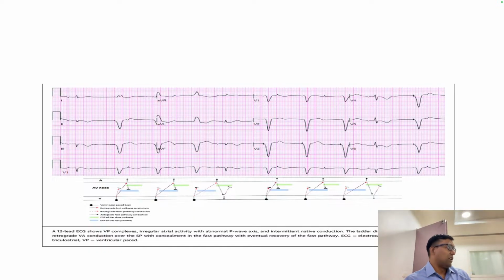Whenever you are taking an ECG with narrow QRS, always think that it is either a junction or an APC getting conducted through the AV node. There's no other way. And then we have to start the hypothesis of P wave positive versus negative. If you are able to see the P wave, you can think about it. Okay, P wave is coming and is negative, meaning it is coming from down to up activation or up to down activation.